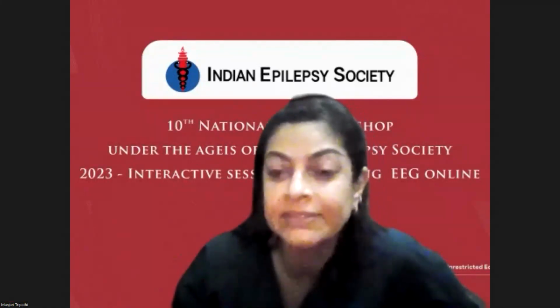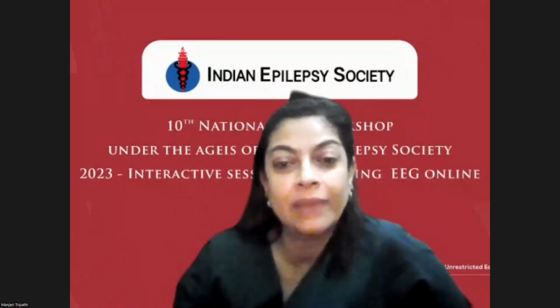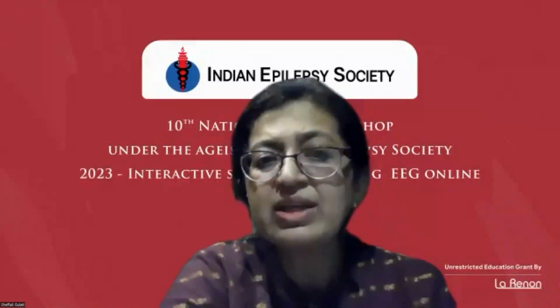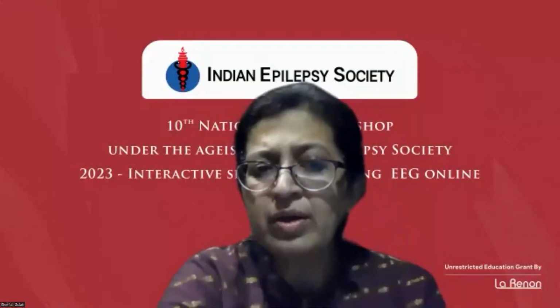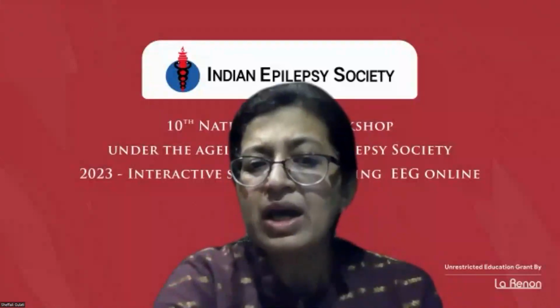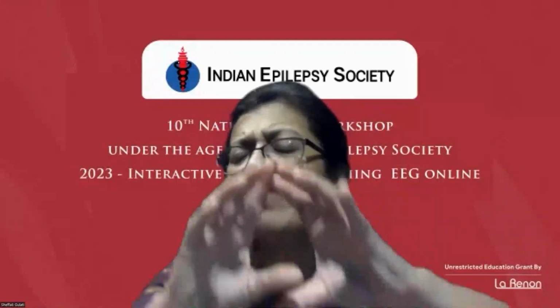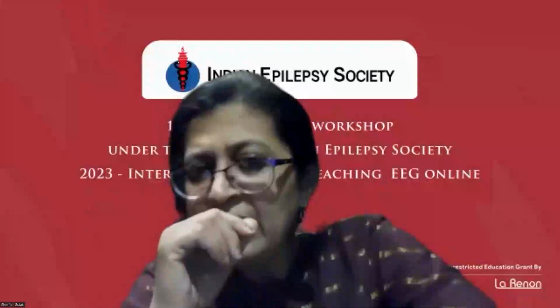So can we get epileptic spasms without hypsarrhythmia and vice versa? Yes, you can get epileptic spasms without hypsarrhythmia. Hypsarrhythmia is not seen in all of the patients. One important thing is that you have to have a complete sleep-wake cycle to pick up these patients for hypsarrhythmia, because it is mostly seen in non-REM sleep, and it is not picked up many times if you do not have a complete cycle. So you need wakefulness, sleep, and then awakening. Children with some cerebral dysgenesis are most likely to have hemihypsarrhythmia or a burst suppression pattern. That also has to be kept in mind.